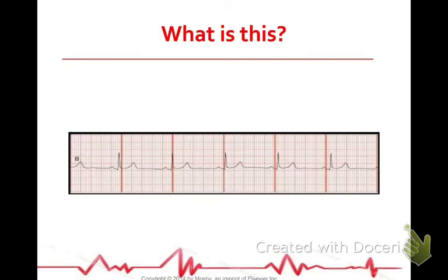What rhythm is this? Let's see. 1, 2, 3, 4, 5. Yep. It's bradycardic.